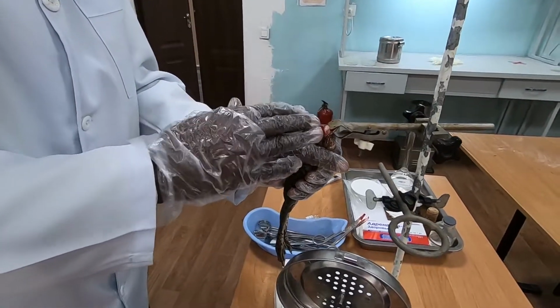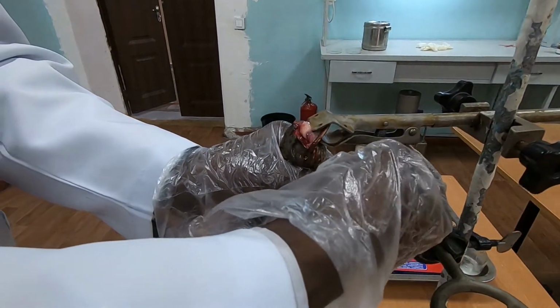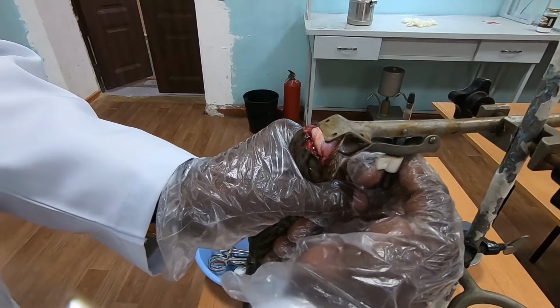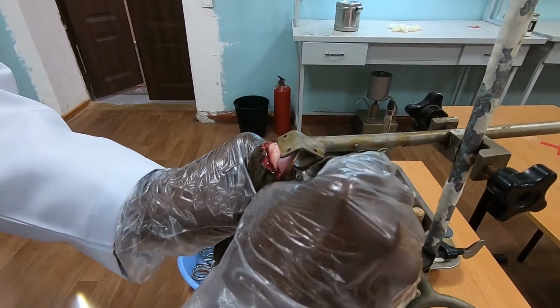Students, we're going to fix it, okay, and allow it to hang. This is how we fix it. We fix it very well so that it doesn't fall off.